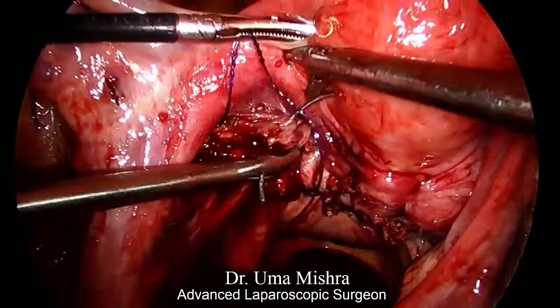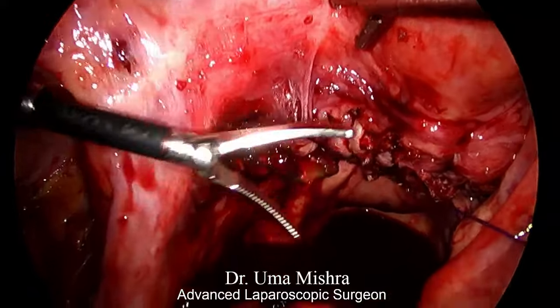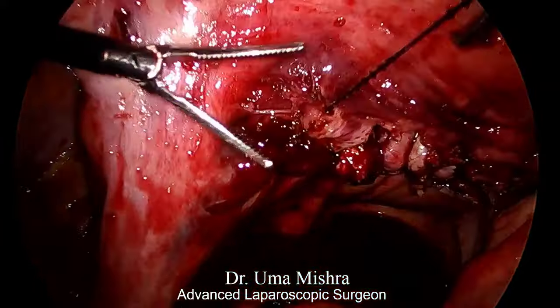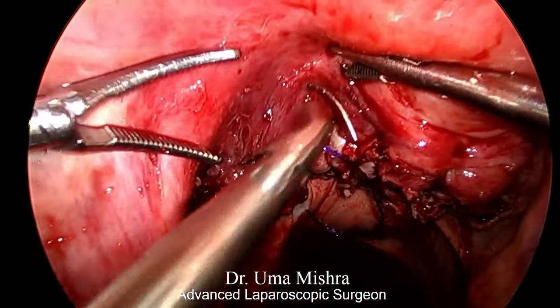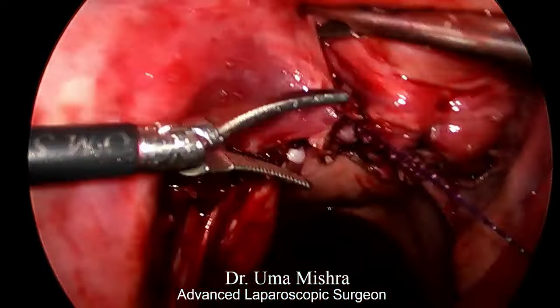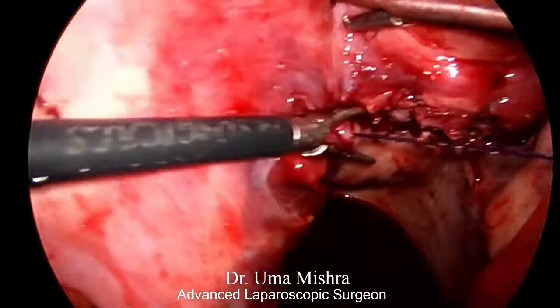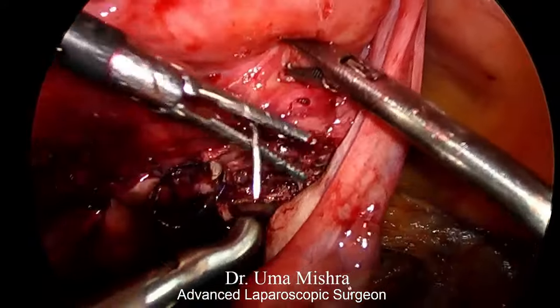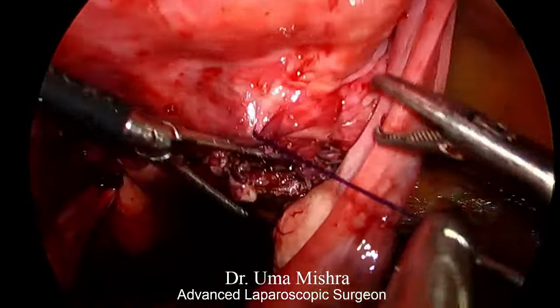So as I mentioned earlier, the line of incision does not matter. What matters is the good outcome and safety to the patient. Whatever ways you are comfortable in suturing, you can decide the line of incision according to your suturing skill.